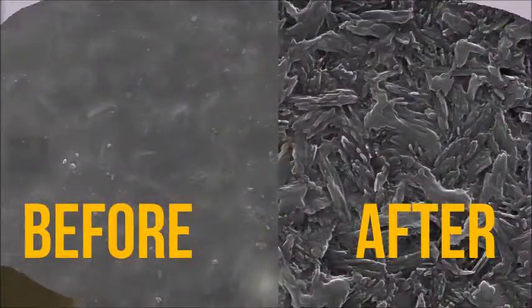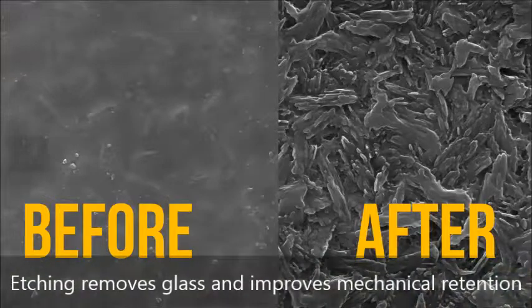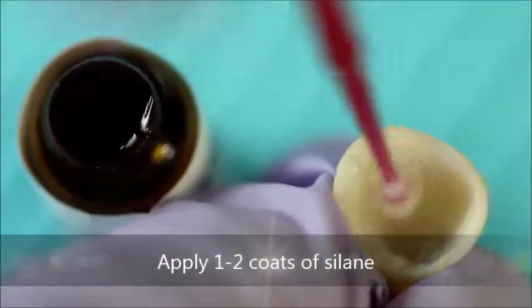Etching lithium disilicate selectively dissolves the glass component, which increases micromechanical retention. The next step is to apply one or two coats of a silane primer.